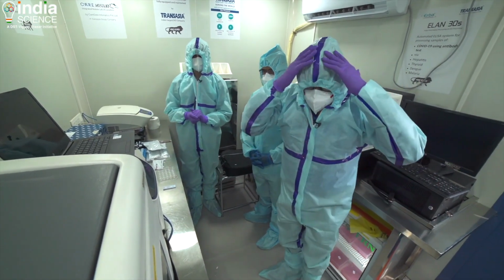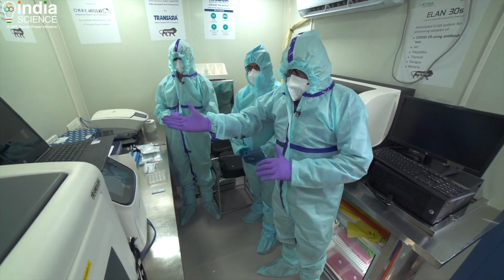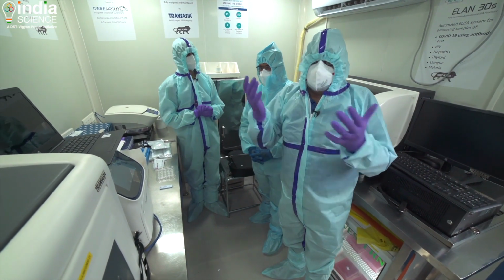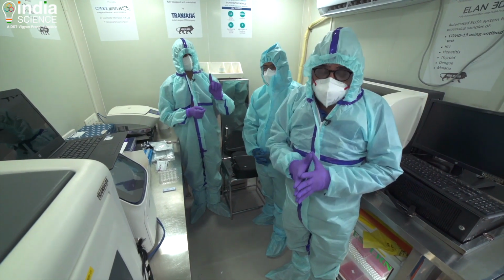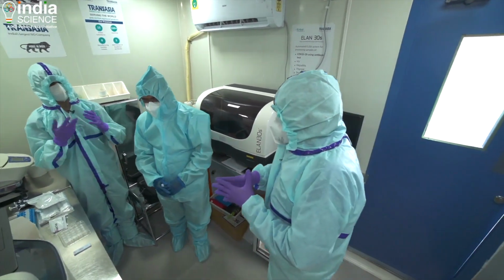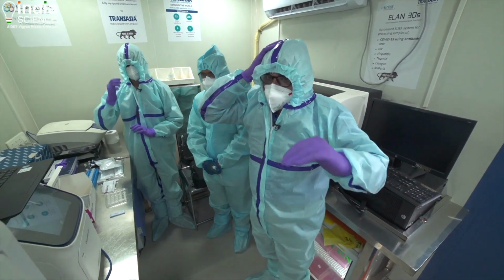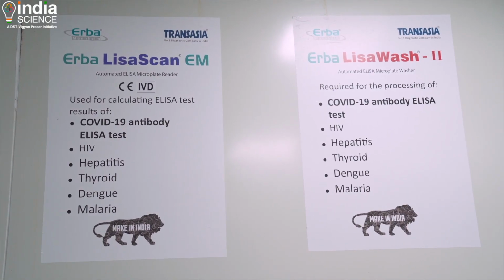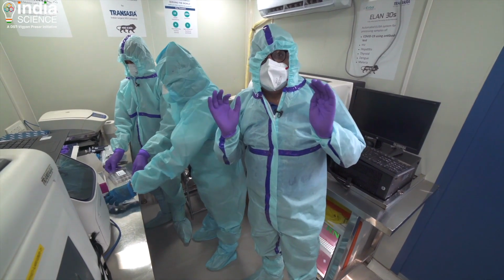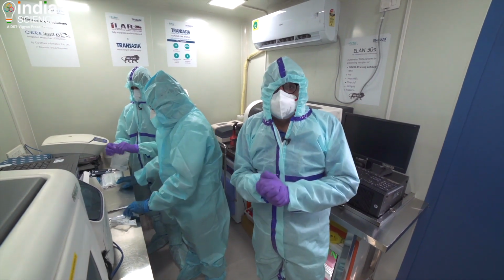All right. So there you saw inside this infectious diseases lab, a mobile lab where RT-PCR tests are done, a rapid antigen test is done, and this can go to any remote area and a test can be conducted. And behind you is the antibody testing machine. So if you are involved in testing antibodies, this is the machine. You can do more than one test here. Right now it is being used for COVID-19 tests, but it can also be used for dengue and for other blood sample testing.